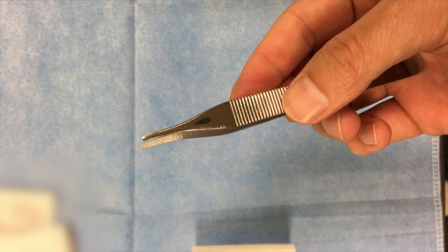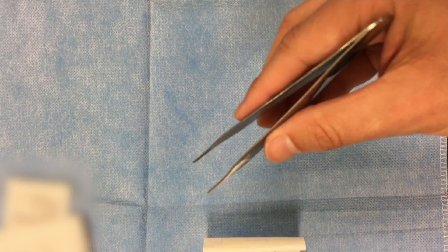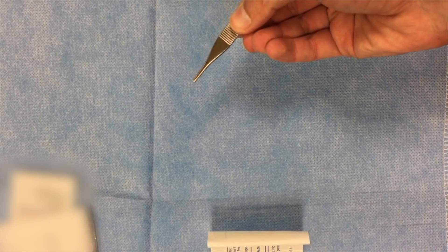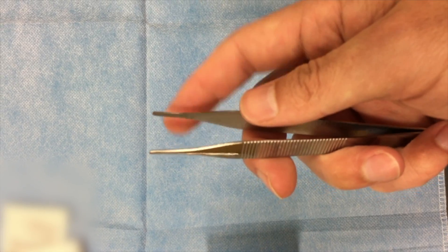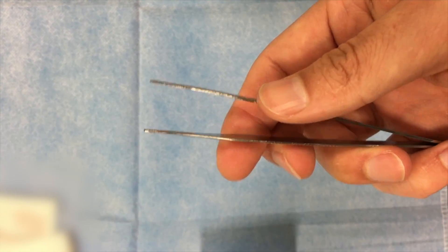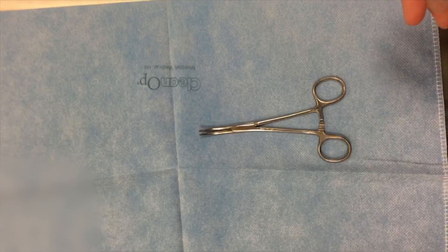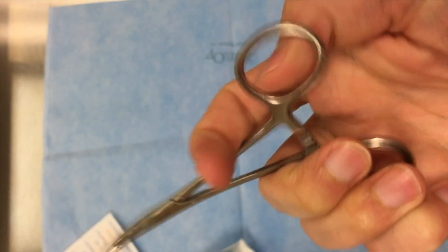These are serrated Adson forceps and you really want to hold them kind of like a pencil. You can lift up skin and open it up if you're doing sutures. You'll notice the ends of these pickups are not sharp, but some Adson pickups can have very sharp small teeth at the end. You have to be careful, because if you're picking up skin and you grab it too tightly you can actually macerate the skin.